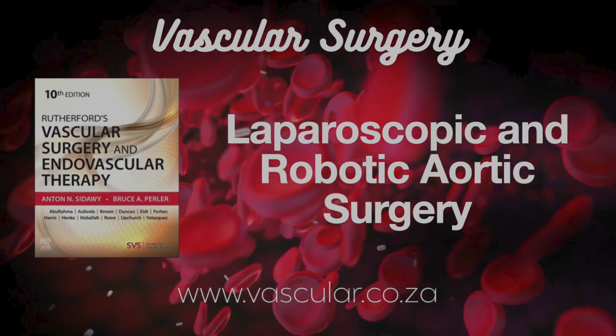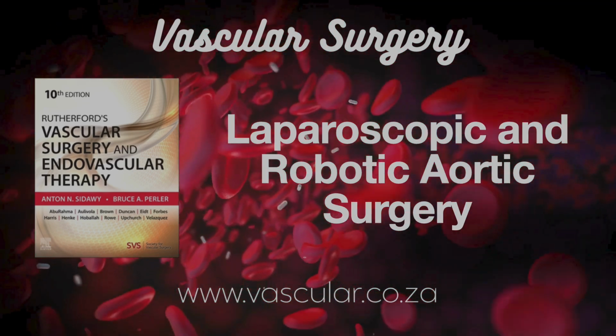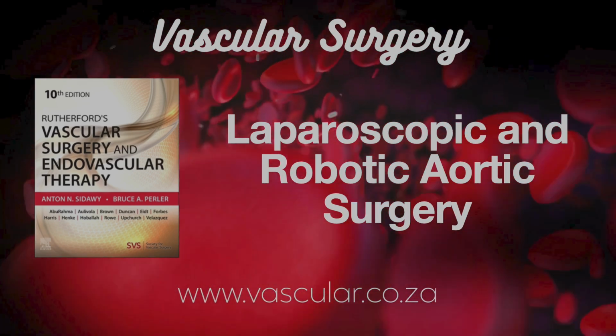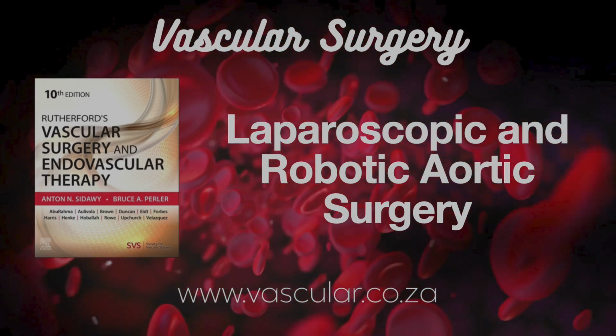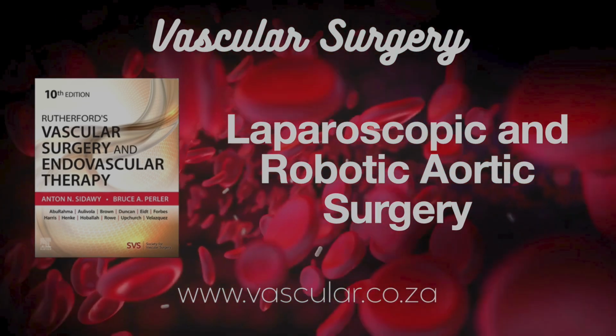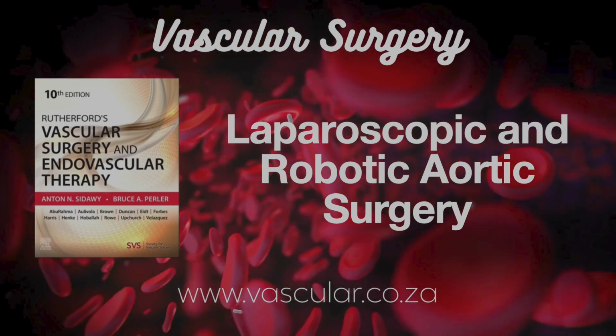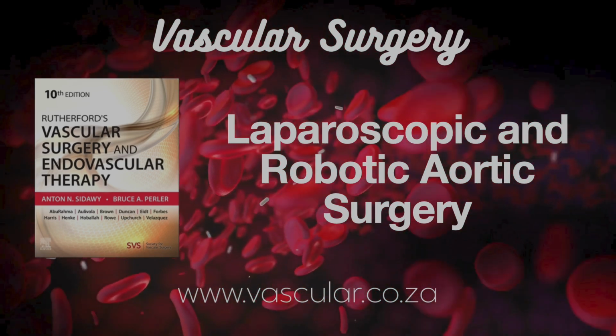So where does the robot really excel in these aortic procedures? It really shines in complex dissections, like working high up near the kidney arteries, the suprarenal aorta, or down low where the aorta splits into the iliacs, very delicate areas. Because of the precision and the view. Makes placing clamps accurately much easier, too.